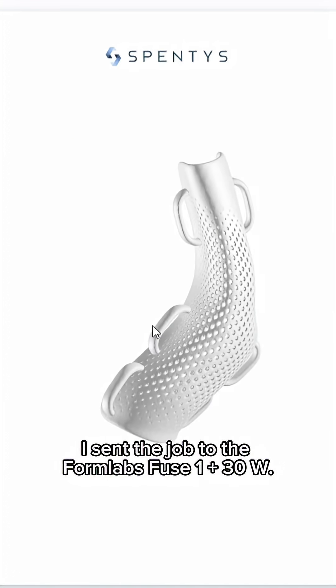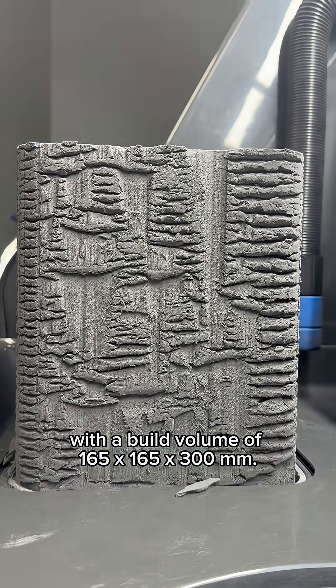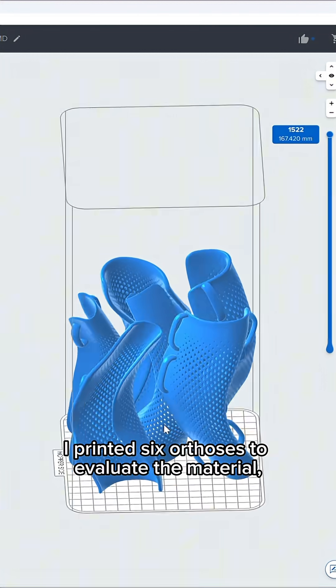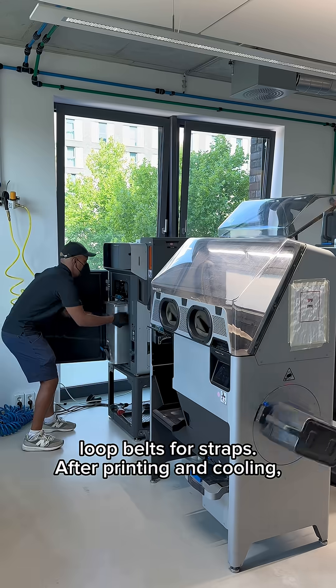Once the file was finalized, I sent the job to the Formlabs Fuse 1+ 30W, an industrial SLS printer with a build volume of 165 x 165 x 300 mm. I printed 6 orthoses to evaluate the material, with wall thicknesses ranging from 2 to 4 mm and fastening options with and without loop belts for straps.